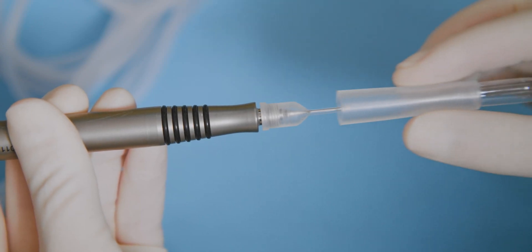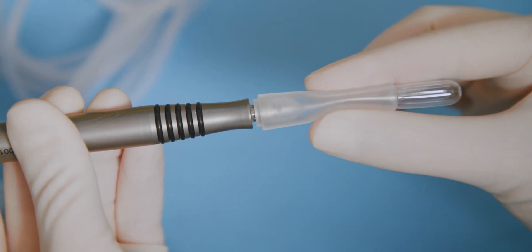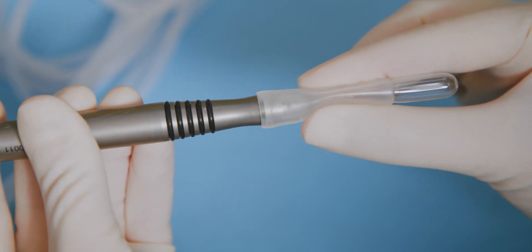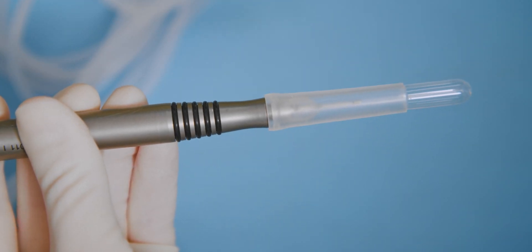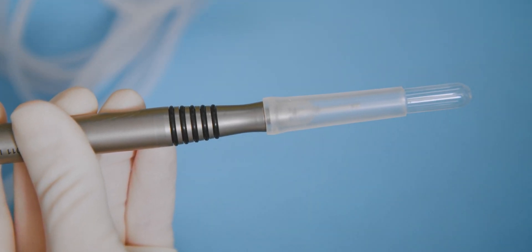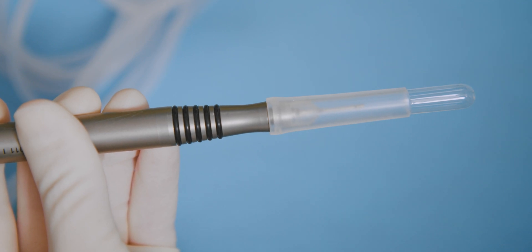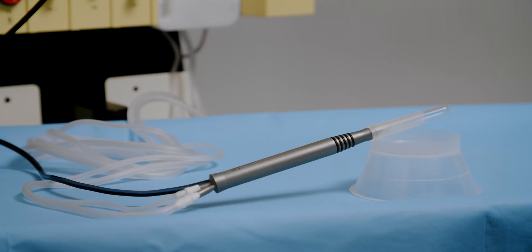Now attach the test chamber. Push the sterile test chamber over the FACO tip and irrigation sleeve. Ensure the back end of the test chamber is flush with the irrigation sleeve. Place the handpiece at a 45 degree angle to ensure optimal priming.